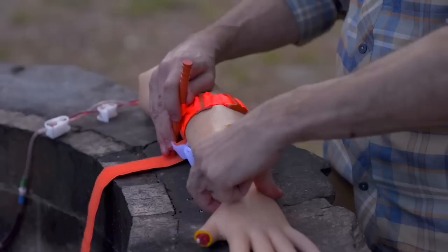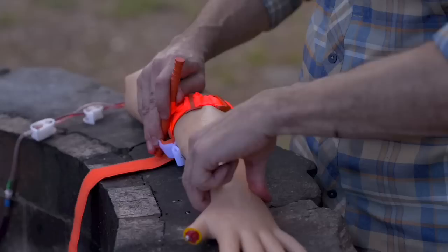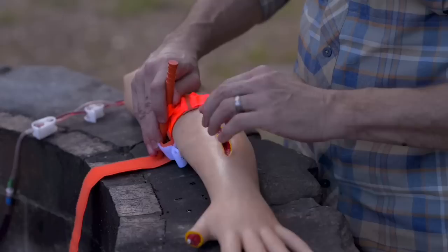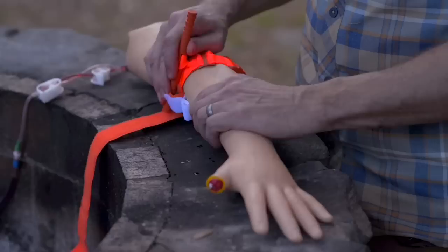Those two things are what you're looking for: bleeding has stopped, and no distal pulse. There could still be some retracted arteries and you could still be losing blood, so make sure you've occluded that blood flow by checking the distal pulse — at this point the pulse should be absent. If you still have a radial pulse, give it a turn or two more. Once you've achieved that, secure the windlass by dropping it into the keeper to prevent it from loosening.